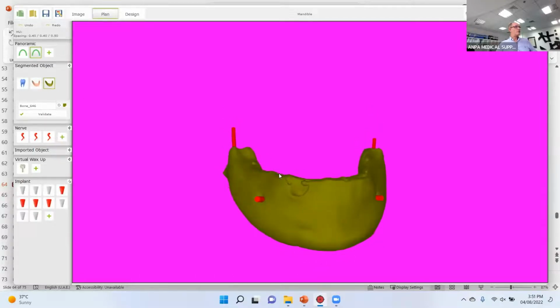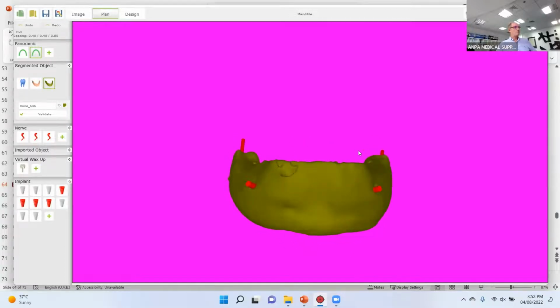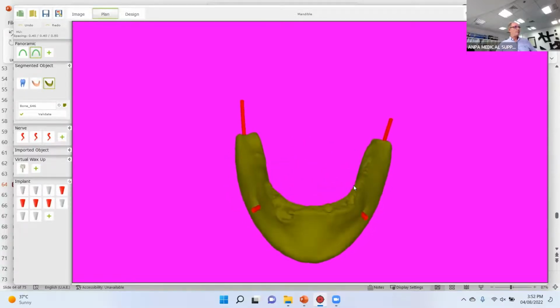and this is once the bone has been reduced. So all the top was removed, and now the implant can be placed. It's flat, it's horizontal, it's clean, and you can place a guide on that. And with the guide, you can place the implant in a very easy way.